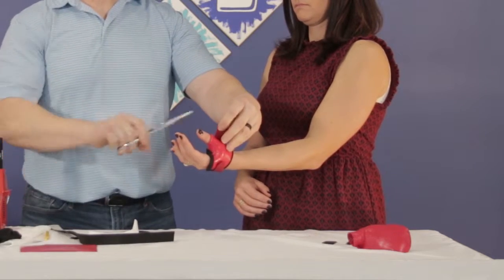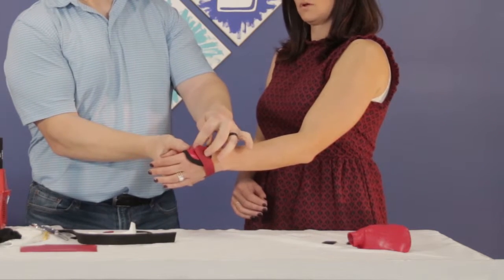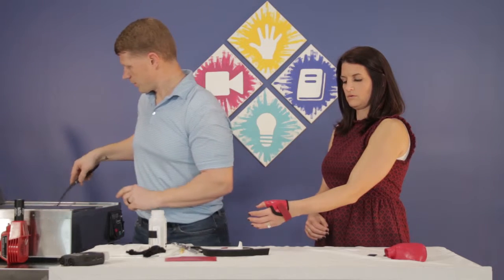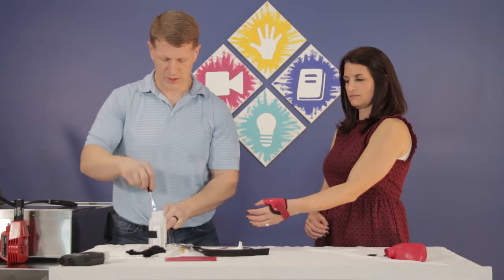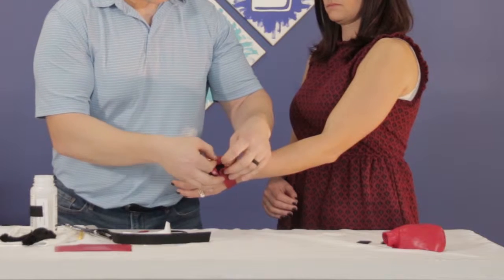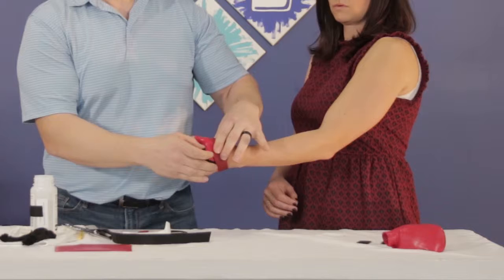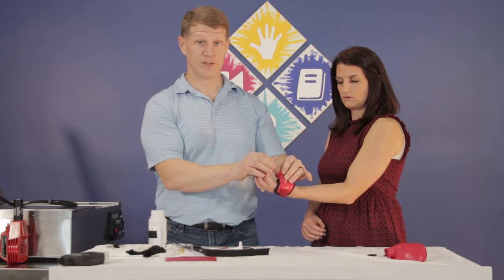I'll trim the strap end to make sure it matches. One thing left: when they pull this off over time, that's going to start to lift that Velcro edge. So I'll take a little bit of solvent, dry off the piece, put just a little bit on there, and lay that over the top of the edge, pressing to make sure it sticks. That's going to make sure that when they lift on that edge, it's not pulling the Velcro up. Now she's got that gentle tip-to-tip touch, CMC is well supported, and IP is free.